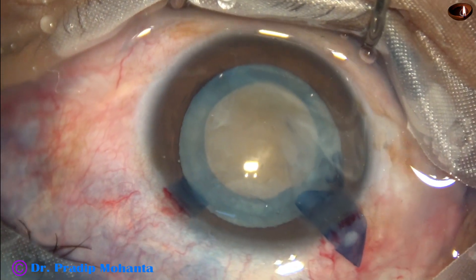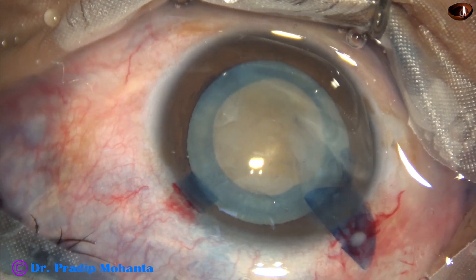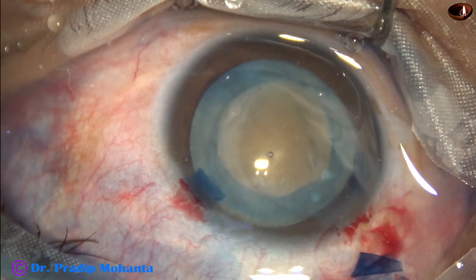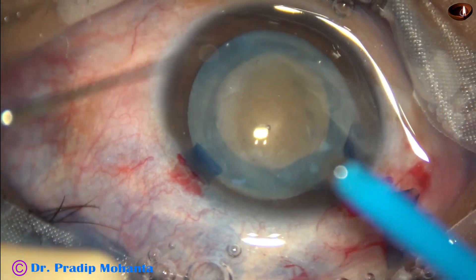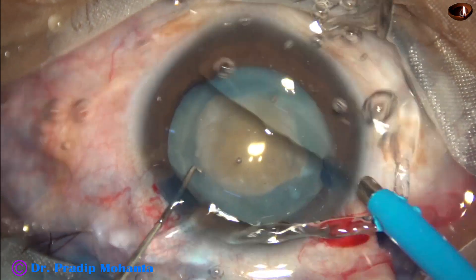And we can see a hard nucleus with leathery fibers. The viscoelastic substance is injected. Now it is the time to enter into the anterior chamber with the phaco needle. The phaco needle goes in with its bevel down.